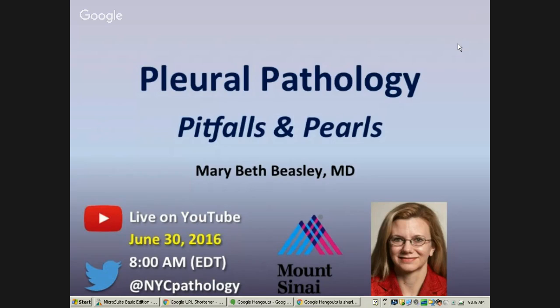Other things people have tried, like desmin, I have not found very helpful in the literature, it's very variable. GLUT1 is another thing that you can use. It's kind of a messy stain though, but we're probably going to evolve to where we have a panel like we do for meso versus adeno, and then maybe if we have all of these things together in a difficult biopsy where you're having trouble seeing definitive invasion, or maybe there's a question, those things will be helpful. But so far, P16 deletion and BAP1 loss, I think, are the best things that are kind of coming up.